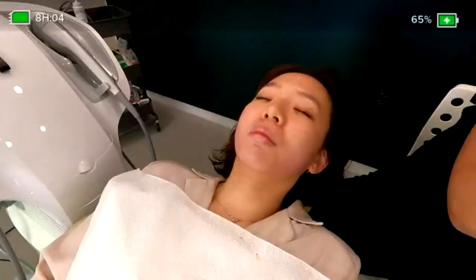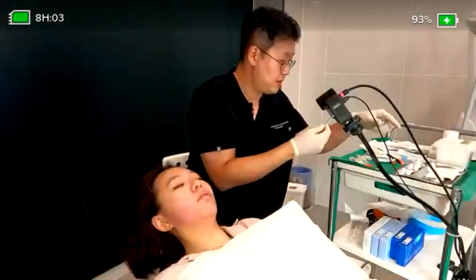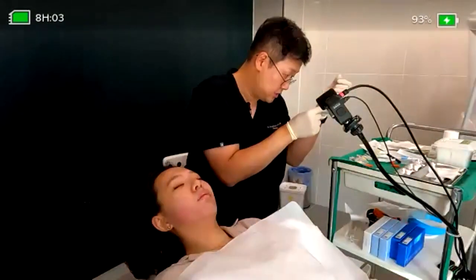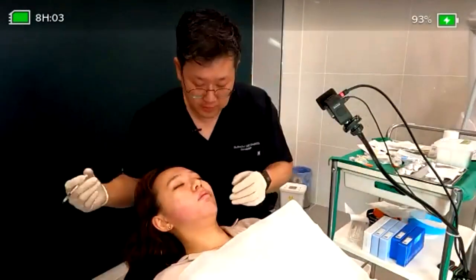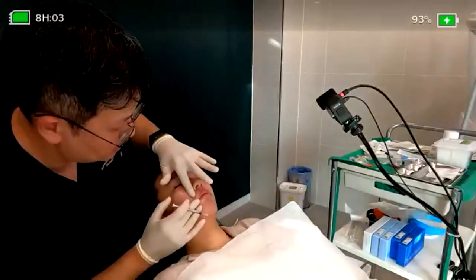Firstly, we will have one more injection for local anesthesia here. Just 4 points. Here, maybe you can just make the pressure here.